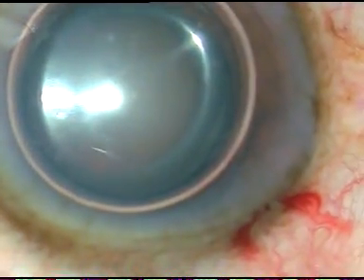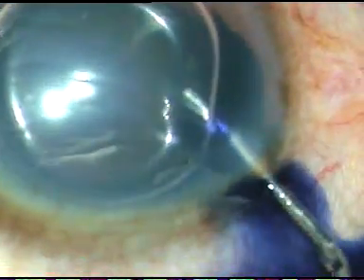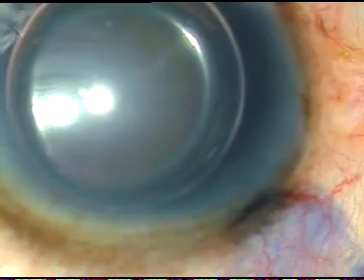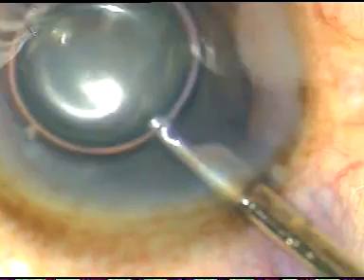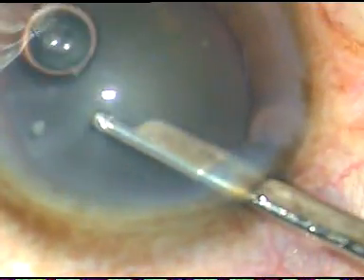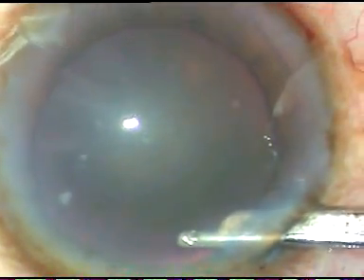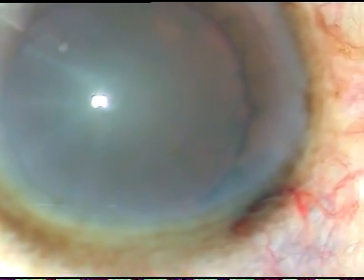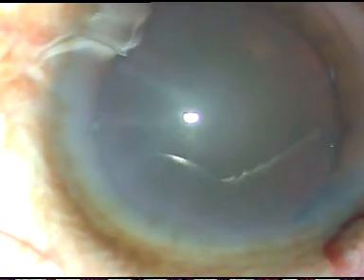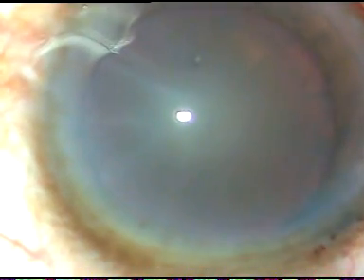By this time, in this case, the main incision and one paracentesis incision have been made and the anterior capsule of the cataract has been stained with trypan blue dye. The dye is then washed out and viscoelastic substance is injected into the anterior chamber. Here it is. This is HPMC, hydroxypropyl methyl cellulose.